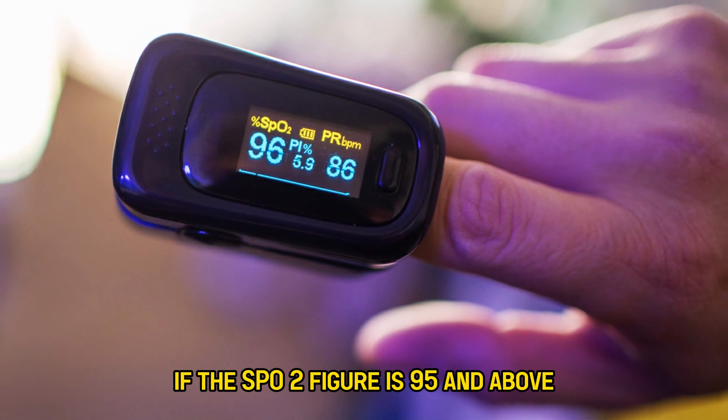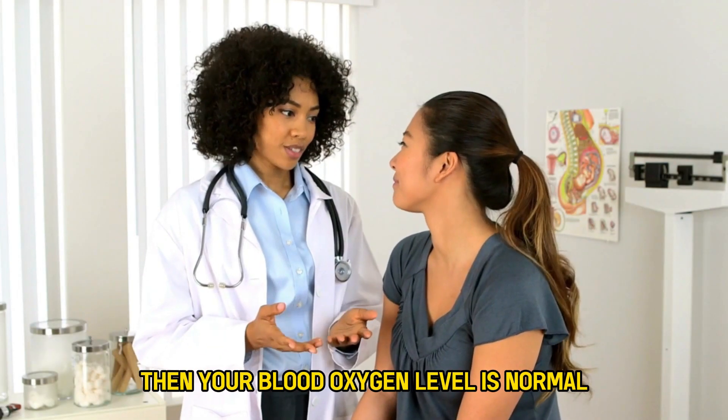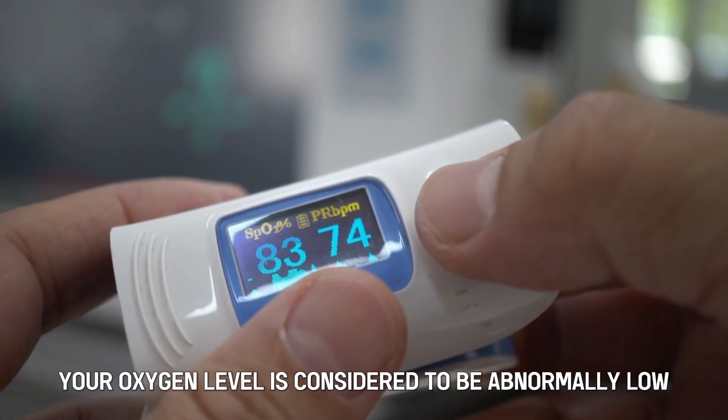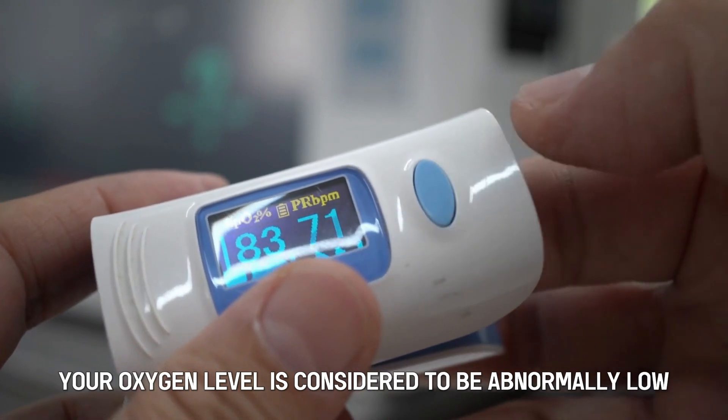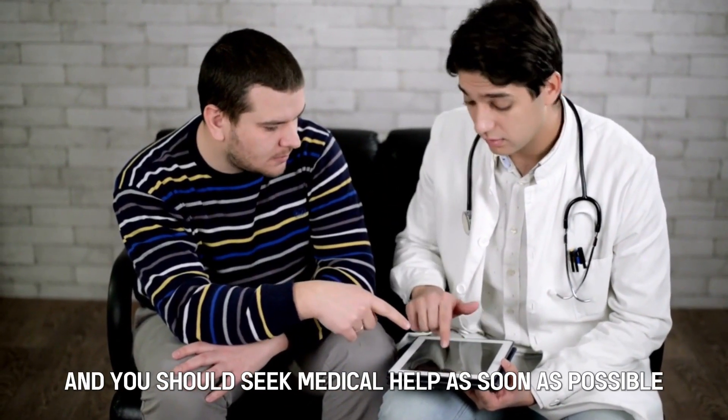Please note: if the SPO2 figure is 95 and above, then your blood oxygen level is normal. But if the figure is 92 or below, your oxygen level is considered to be abnormally low and you should seek medical help as soon as possible.